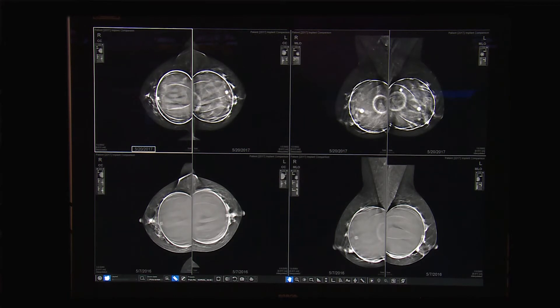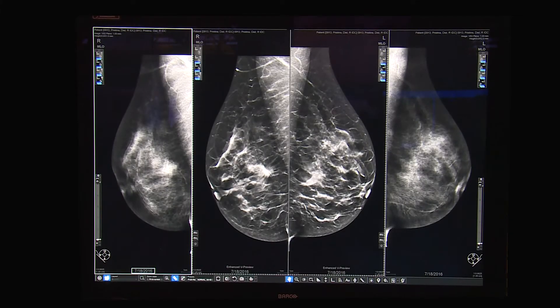This is also great evidence of how, with Pristina and its design, we are able to capture more breast tissue compared to previous years with other systems.